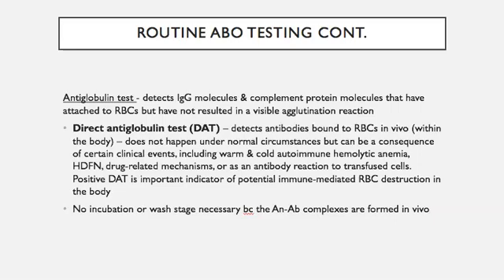A positive DAT is an important indicator of potential immune-mediated red cell destruction in the body. This goes back to some of the concepts that we talked about in Unit 1. Your body is recognizing something as foreign, and it's going to attack. In the DAT, there is no incubation or wash stage necessary because those antigen-antibody complexes have already been formed in vivo.